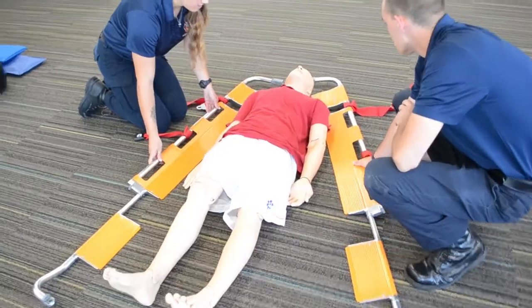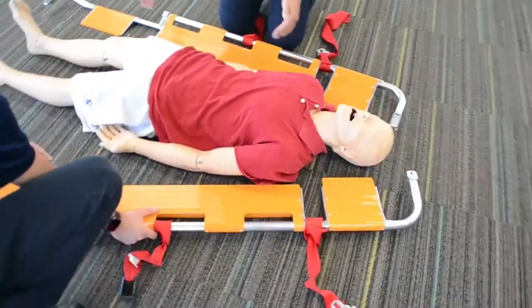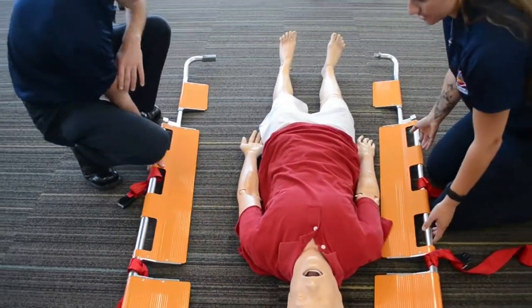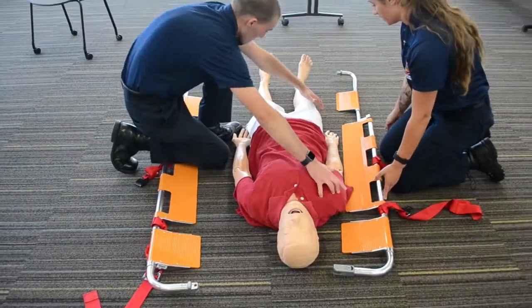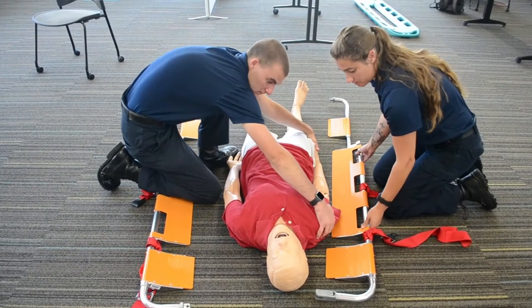In order to get the patient on, depending on what the mechanism was and what's injured, you can do a small log roll to get the patient on. First we're gonna put my side under, so my partner is gonna grab him at the shoulder and around the hip and do a small log roll.